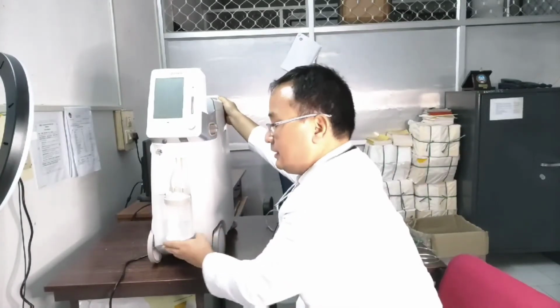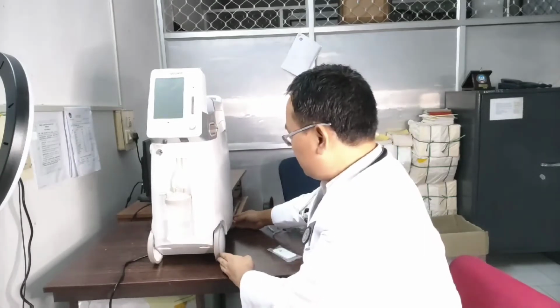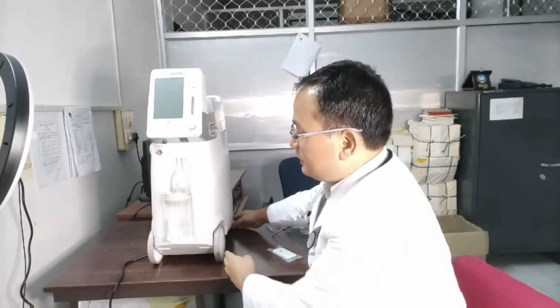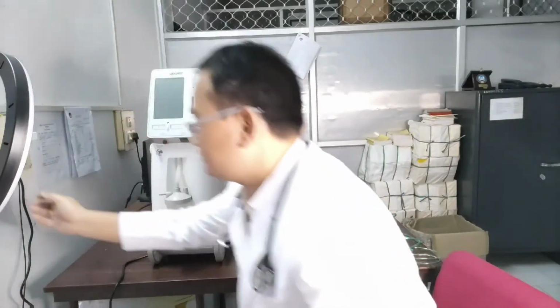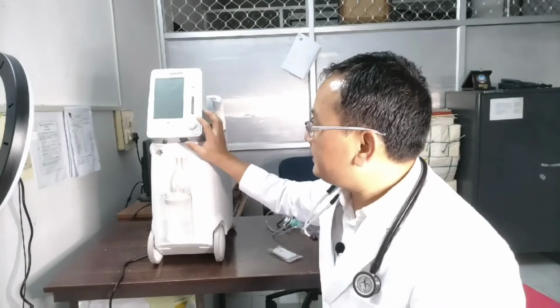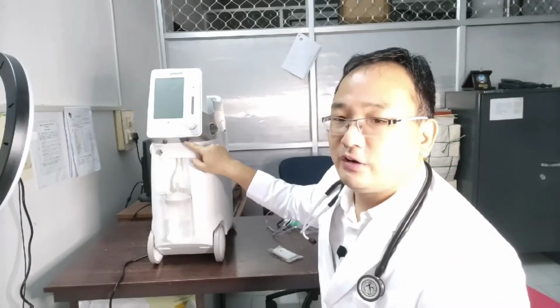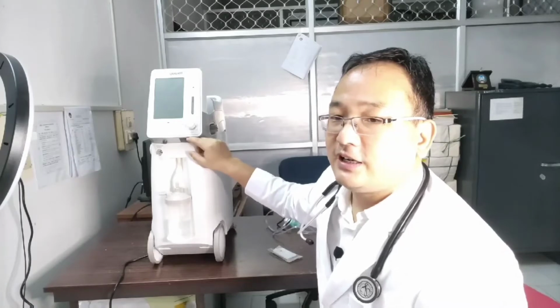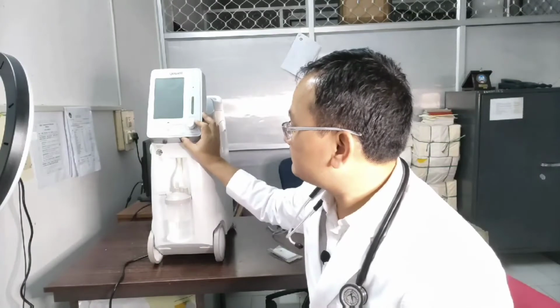So now I will stabilize this, so I will put the brake. Now let's switch on the oxygen concentrator and see how it operates. As I said, here is the on and off switch. I will switch it on, and then let's see how the oxygen concentrator works.